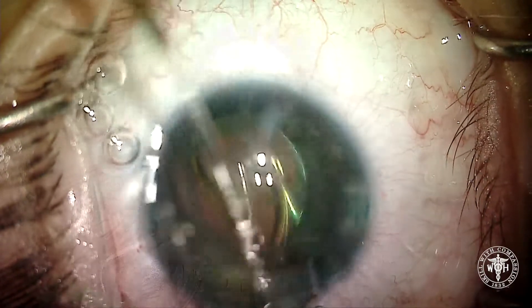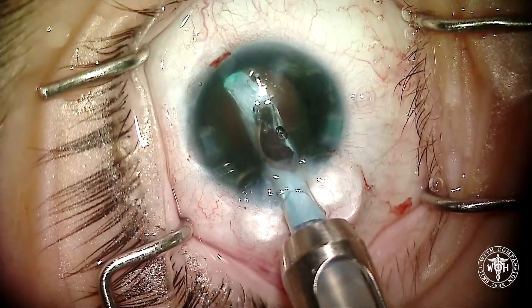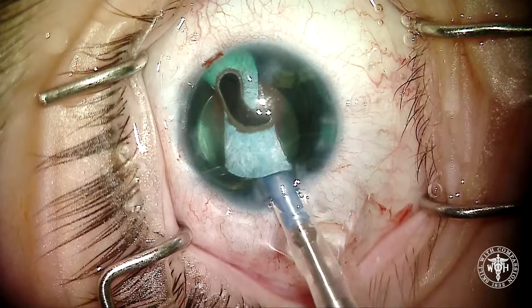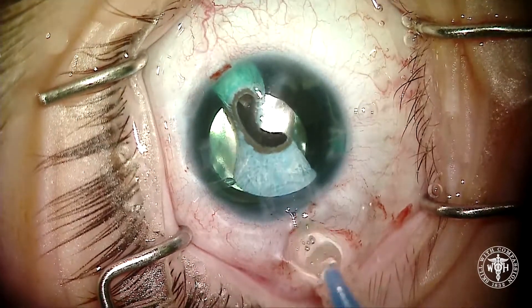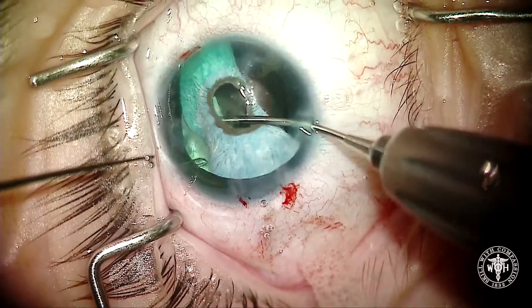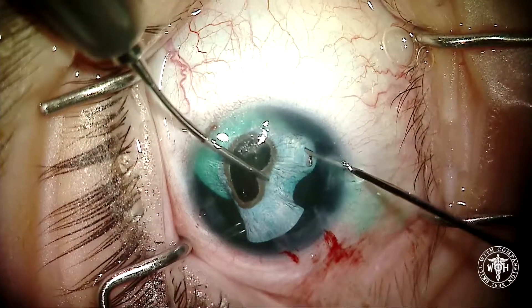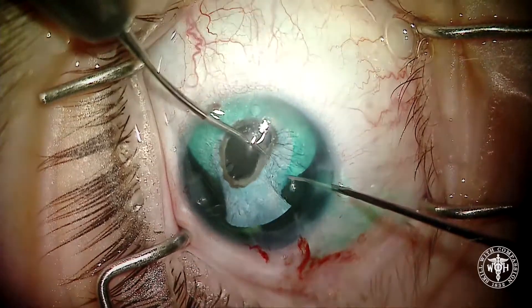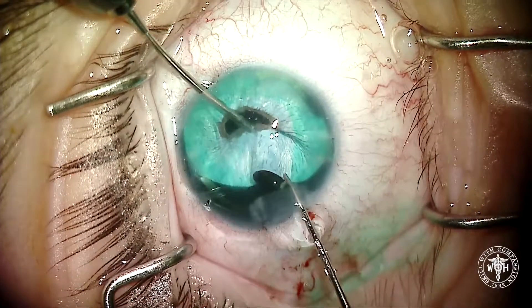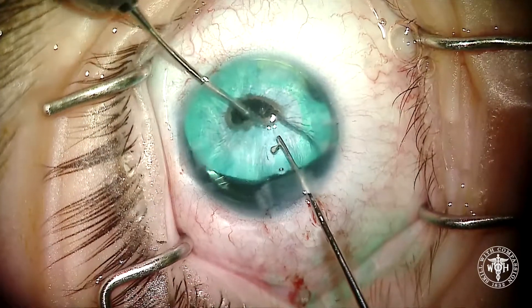The IOL goes in, and now we're going to add some viscoelastic to deepen the chamber and then inject our artificial iris. This is a large silicone implant — this is the without-fiber artificial iris — and you can see that leading edge goes into the capsular bag. Now with the help of a Snyder Grasper, which is a 25-gauge micro forcep, as well as a lens positioner, we carefully grab the artificial pupil border, twist the forcep to shorten the cord length of the artificial iris, and then carefully dunk that into the capsular bag. There we go.